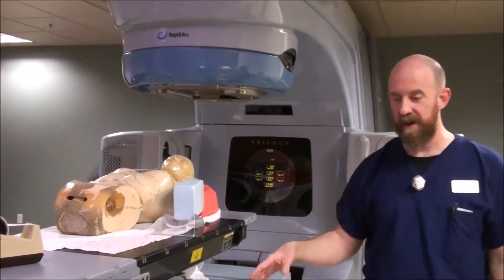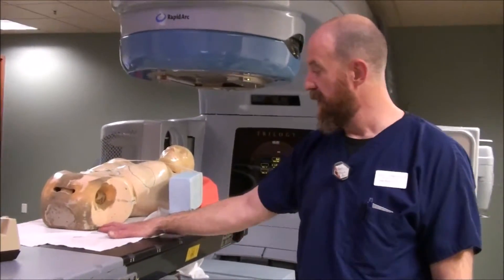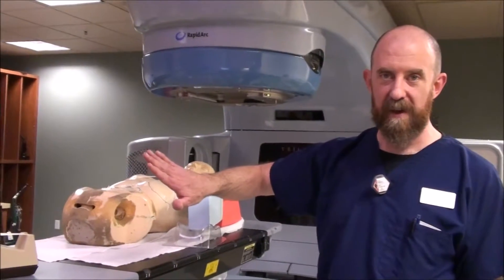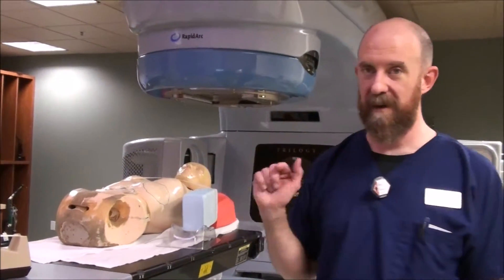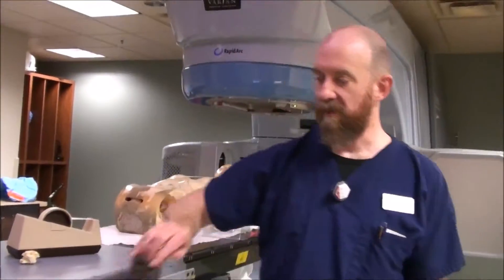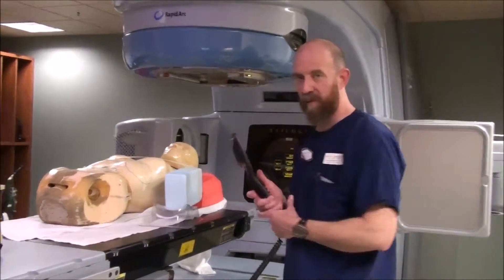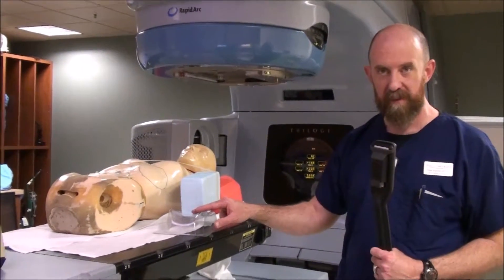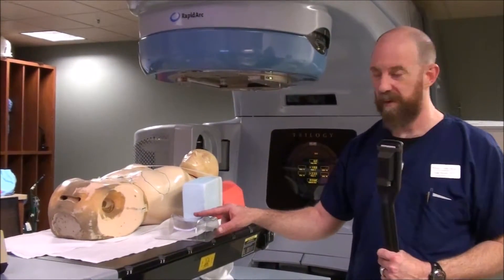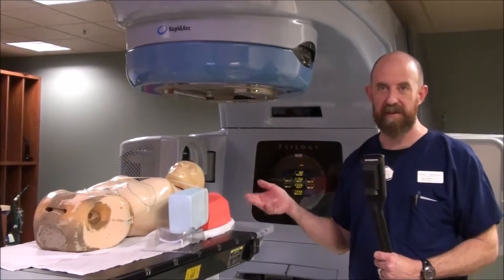Now that the patient is set up, make sure that the headrest is fully on or fully off any table pad. You don't want it rocking sideways on the side of a table pad — that leads to instability and non-reproducibility. Reproducibility is something we're going to talk about every time. This is more reproducible than a lot of other things you could do to prop the elbow up. You want something stable, secure, and simple. Simplicity and stability make reproducibility.